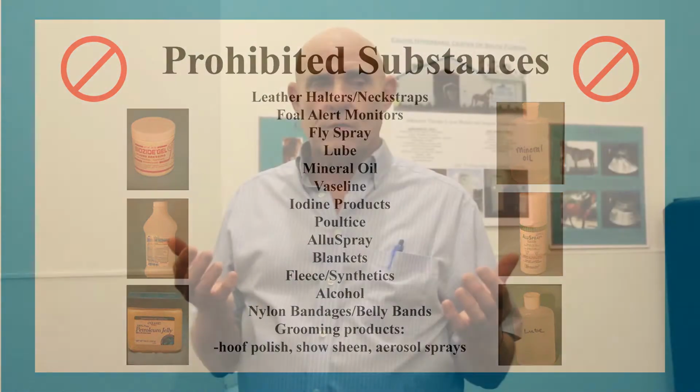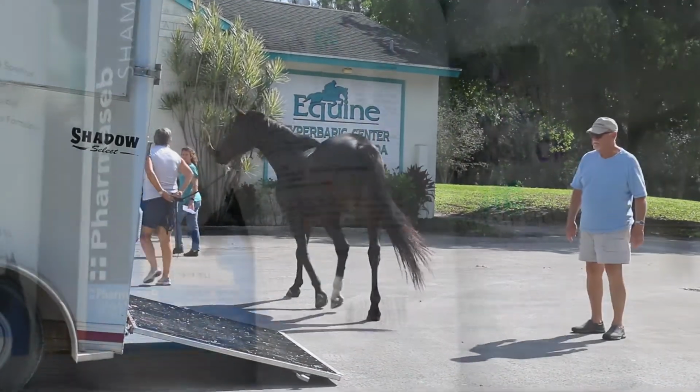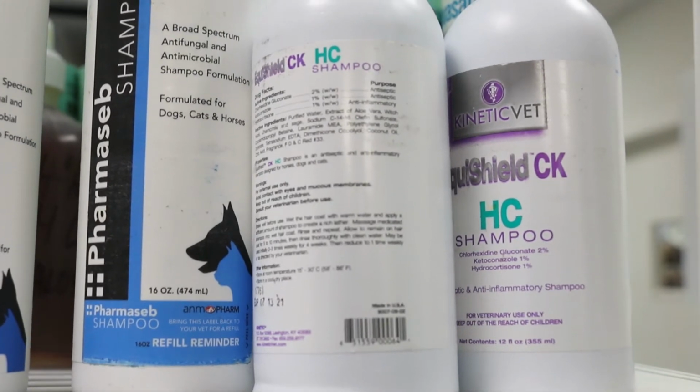Fly sprays. Technicians are trained to smell the horse. If they smell like fly spray, they're going to have to take a bath. We give them a bath anyway. But we don't let Vaseline or any of those accelerants in the chamber.